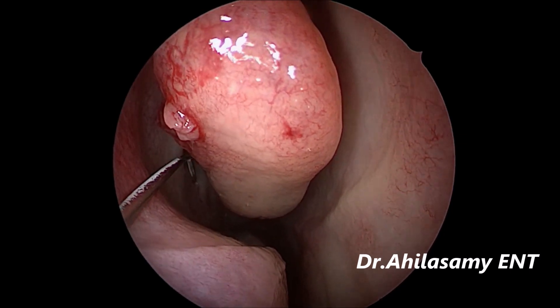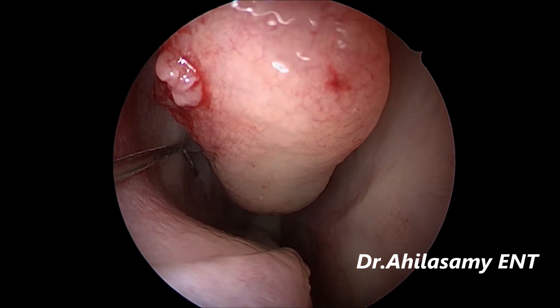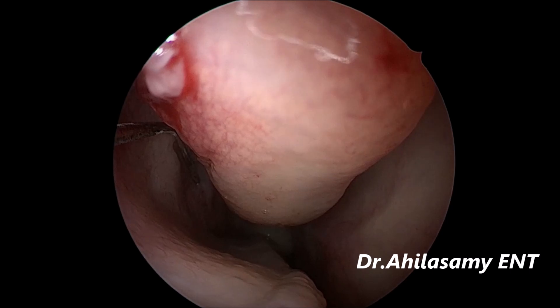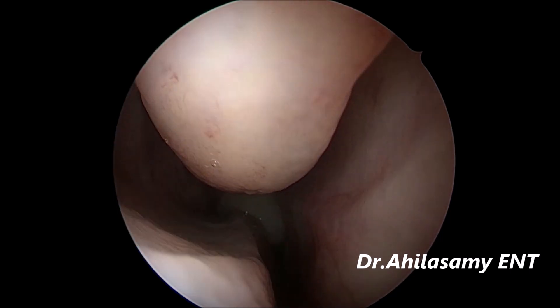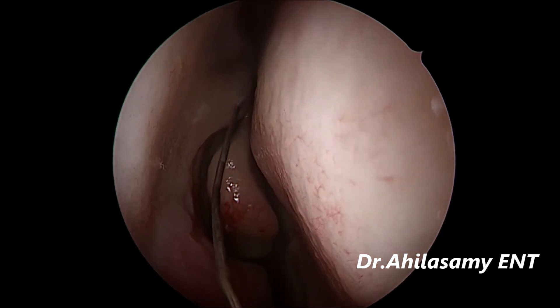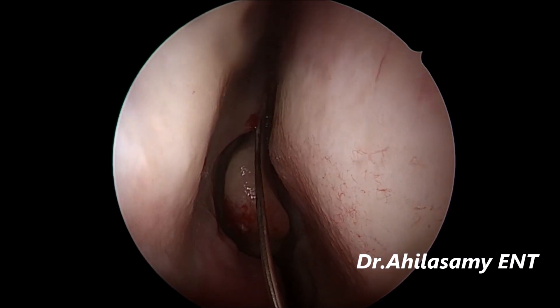You can see some secretions coming out and going into the nasopharynx. Please watch these videos on big monitors — don't watch on mobile phones, you can't appreciate the details. See the fluid discharge going into the nasopharynx while I am giving this sphenopalatine block. Now I am giving the anterior ethmoidal nerve block because I am doing middle turbinate surgery too — that's the concha crushing.